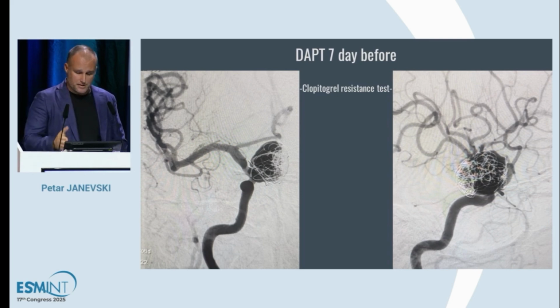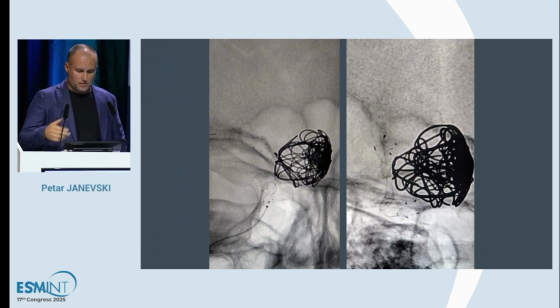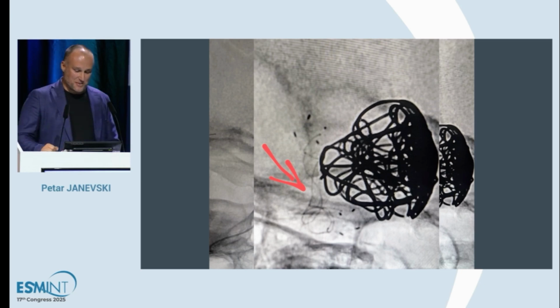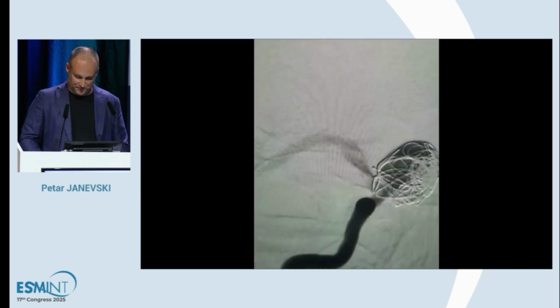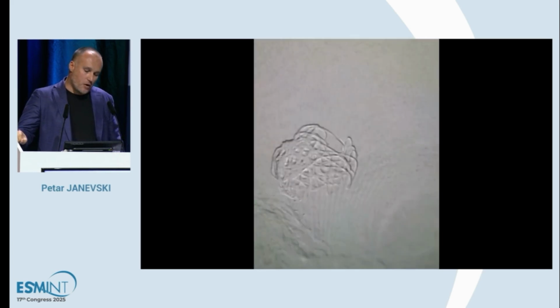This is the initial angiogram, which was more or less the same as the one we did 2 weeks before. The implantation of the stent itself was uneventful, but we saw that it didn't open at the level of the stenosis, of course. We expected that. I don't know if I'm allowed to say, I'm just kidding. It's FRED X. So this is the part where the stenosis was. This was the control angiogram, and we hoped that it's enough.